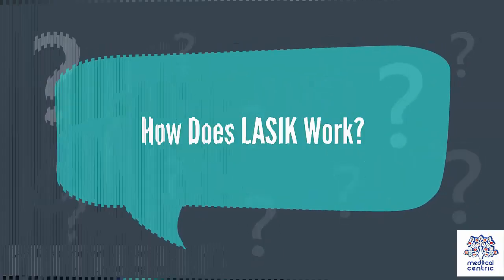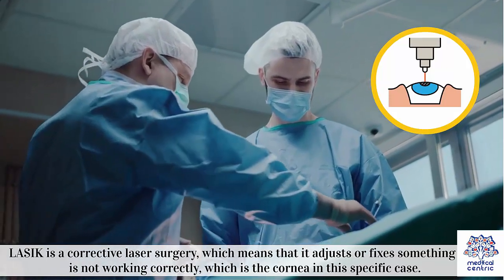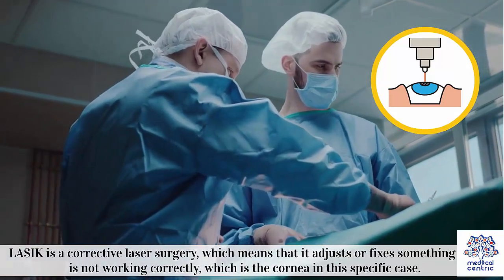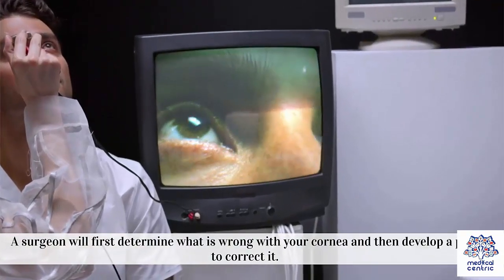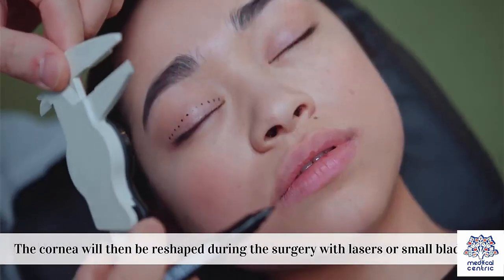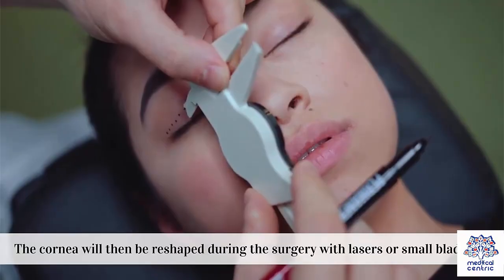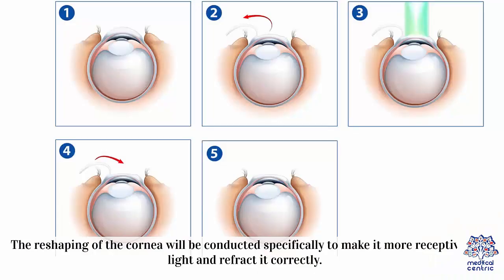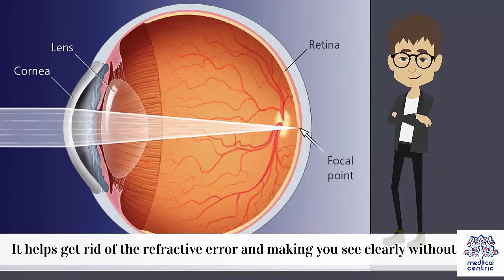How does LASIK work? LASIK is a corrective laser surgery, which means that it adjusts or fixes something that is not working correctly, which is the cornea in this specific case. A surgeon will first determine what is wrong with your cornea and then develop a plan to correct it. The cornea will then be reshaped during the surgery with lasers or small blades, specifically to make it more receptive to light and refract it correctly. It helps get rid of the refractive error and making you see clearly without blur.